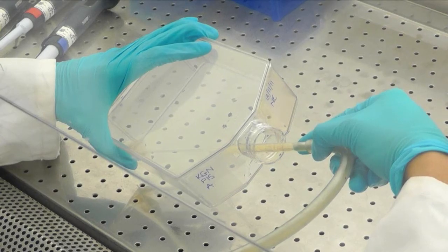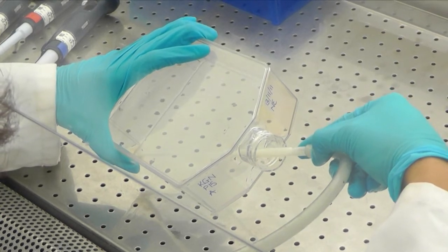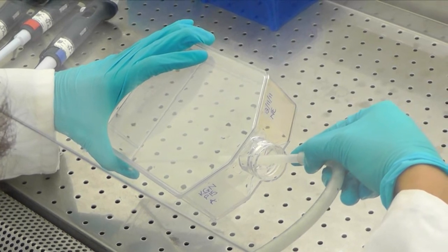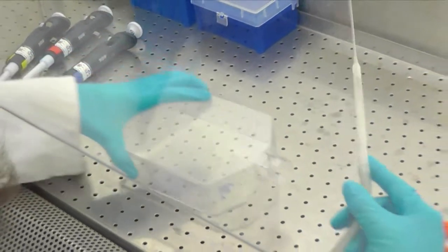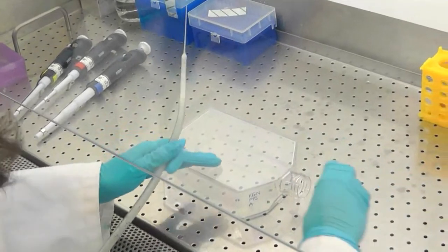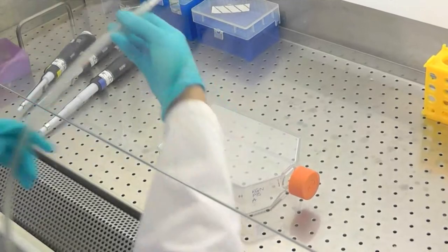To passage the cells, the media bathing the cells first needs to be removed. This can be done using a glass pipette attached to a suction tube as shown here. It is recommended that you ensure the suction tube is sterile before use to prevent contamination of your culture. Don't touch the bottom of the flask as this can disturb the cells. Tilt the flask instead, as this ensures that all the media is in one corner and will make it easier to aspirate.